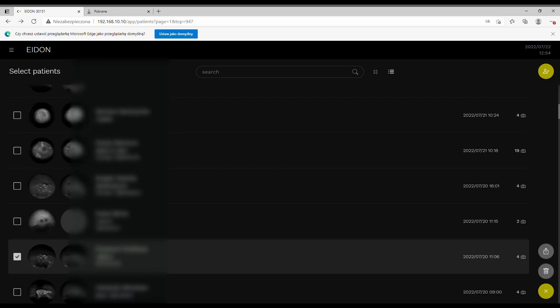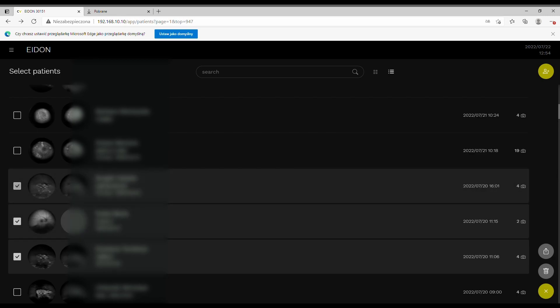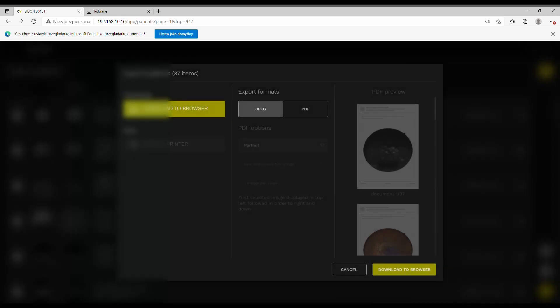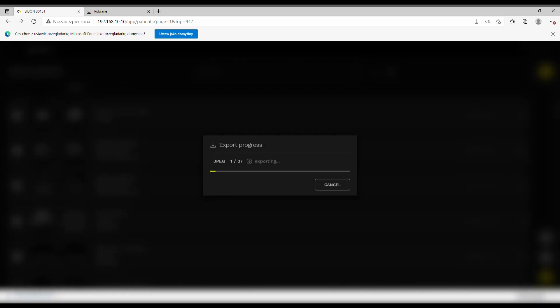You can also use mass export — clicking multiple patients lets you download all images to your download folder, choosing either JPEGs or PDFs. Unfortunately there is no TIF or RAW export, which might be a problem for people heavily into imaging. Also a downside of mosaics is that they have the same resolution as a single shot, so you effectively decrease the resolution of the image.